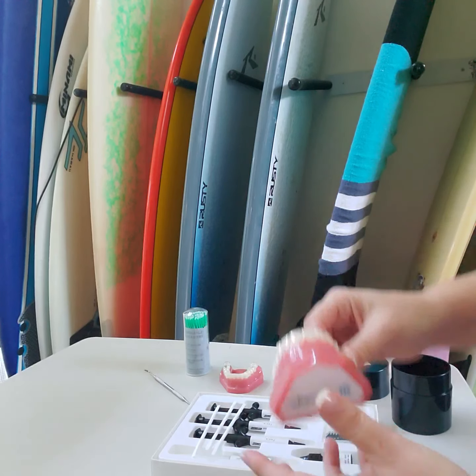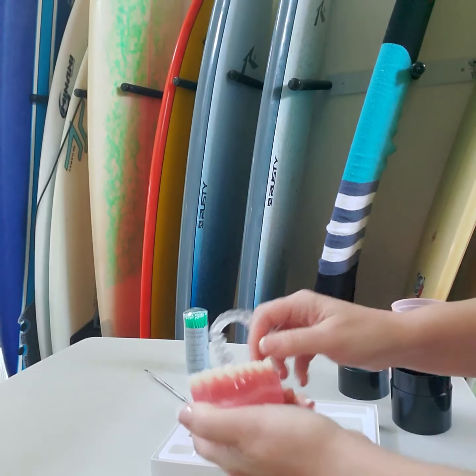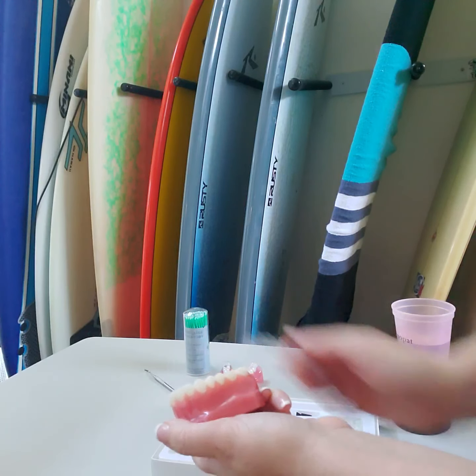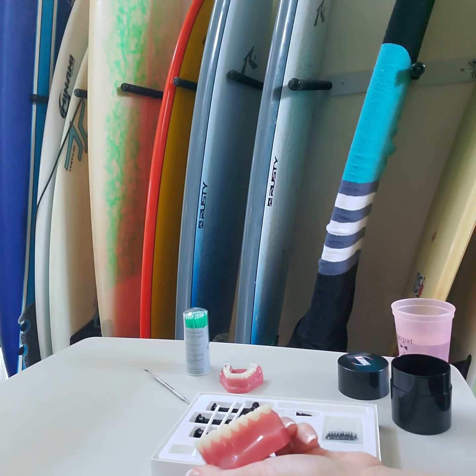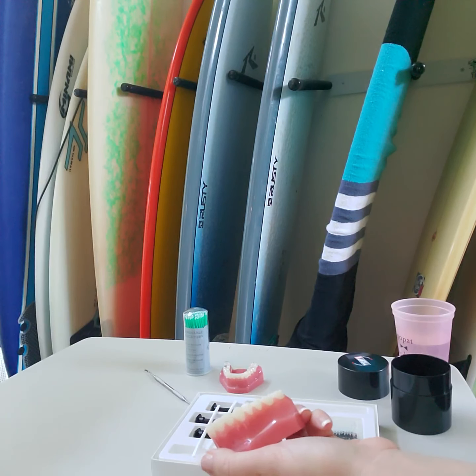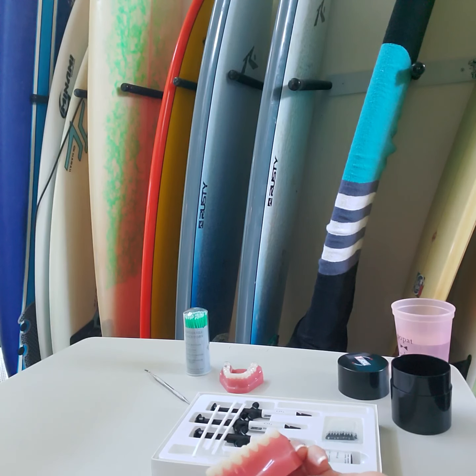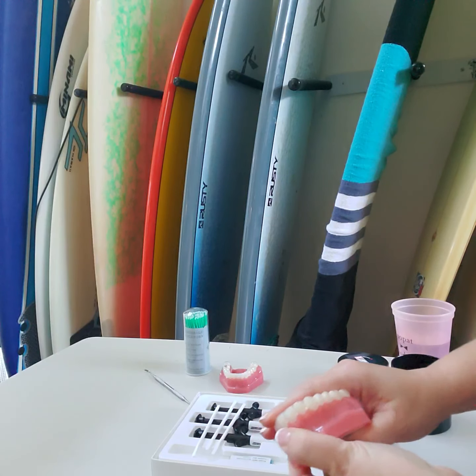So what are attachments? Attachments are the little nubbins that are on the teeth, and you're going to be the ones putting them on. They act as a handle to help move the tooth either quicker or more efficiently. You take them off at the end. If you do end up needing a revision refinement, you should take them off before you rescan or reimpress. You always get a better outcome if you do that. If you can do a composite filling, you can do attachments.